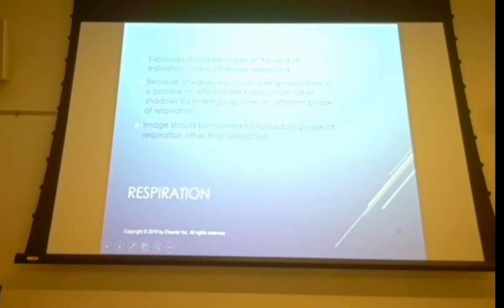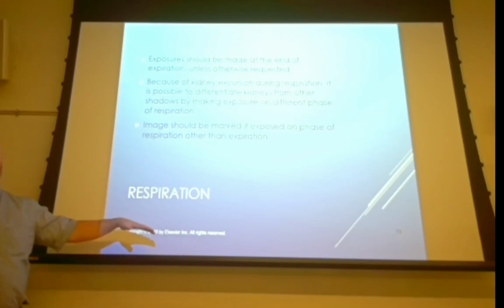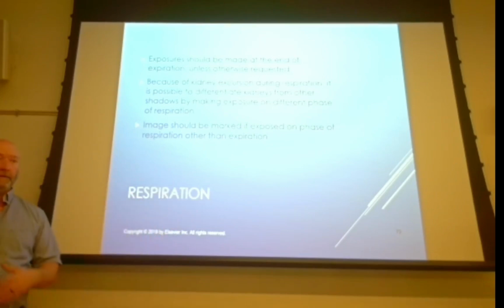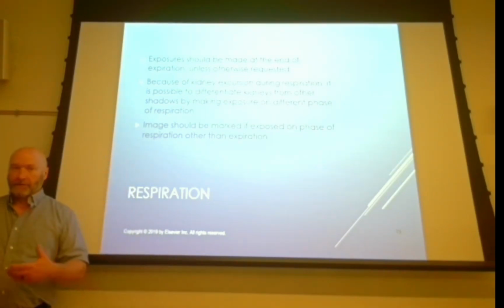All right, so respiration, most of the time we're going to shoot on full exhalation. If you're a radiologist, the preference of the radiologist in the hospital is shoot on inspiration, then go with that. Just know that all the way through the registry, the answer on any test that you take is for an IVP, KUB, whatever, you're going to shoot on expiration. And the reason for that is because of those interactions that we've been talking about in imaging and radiobiology.